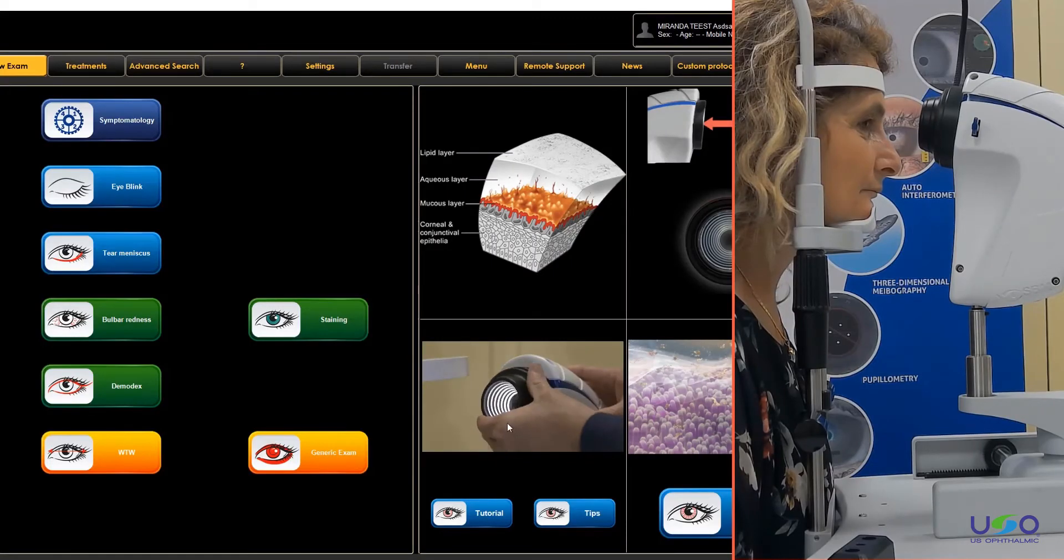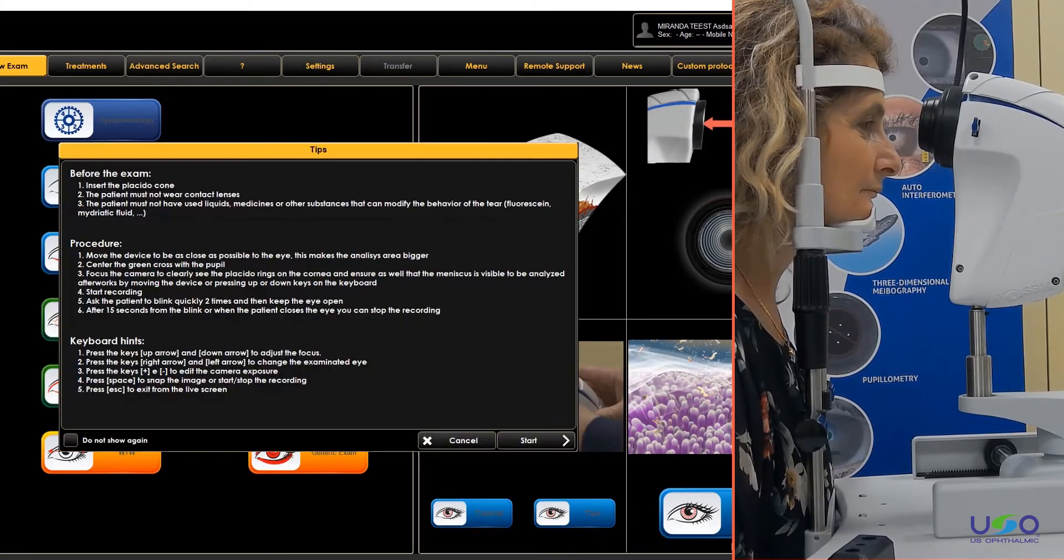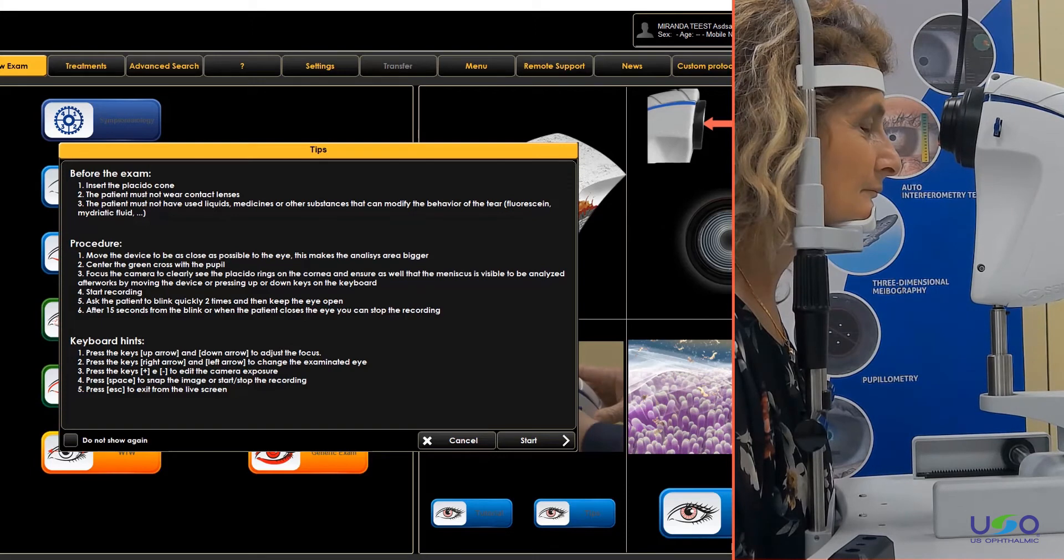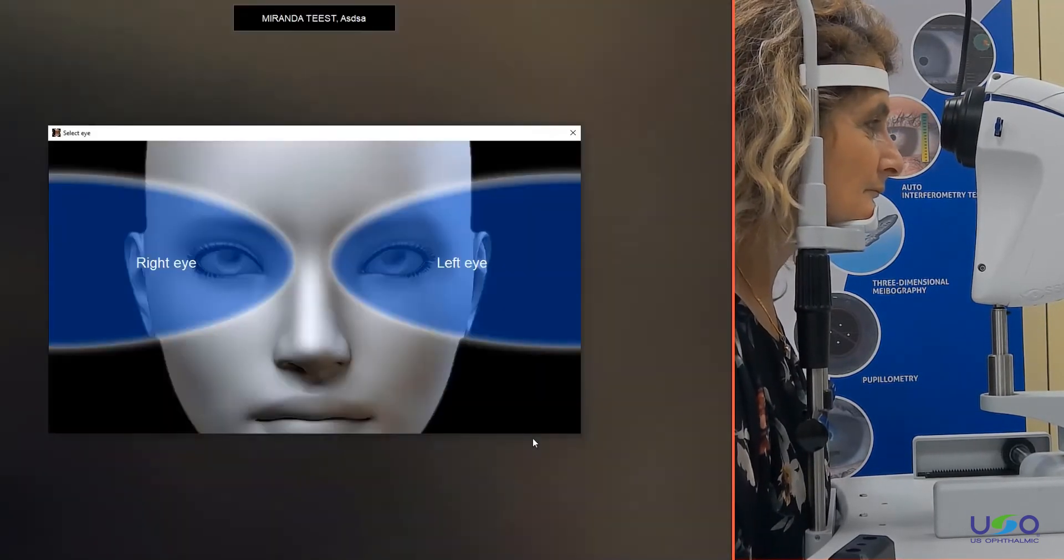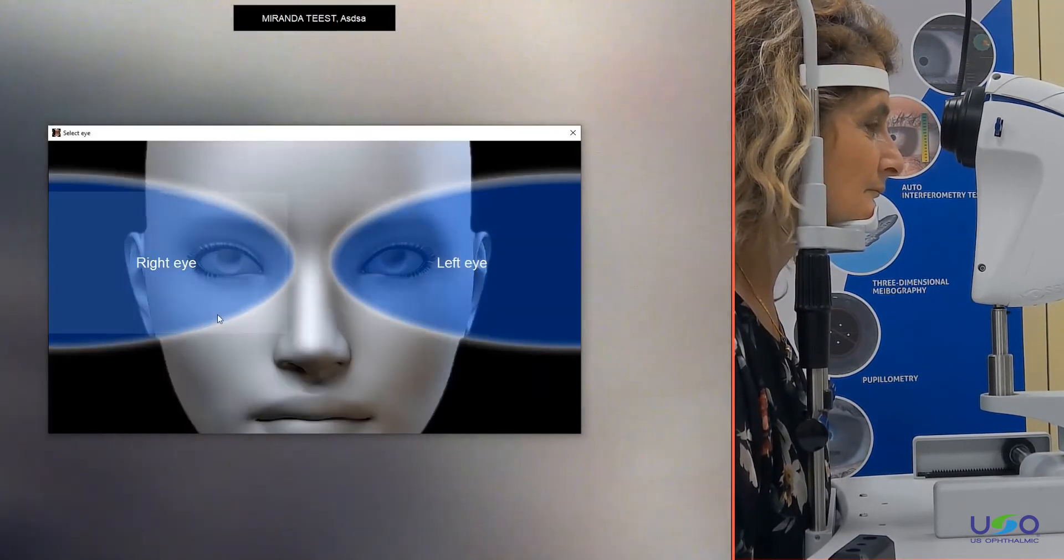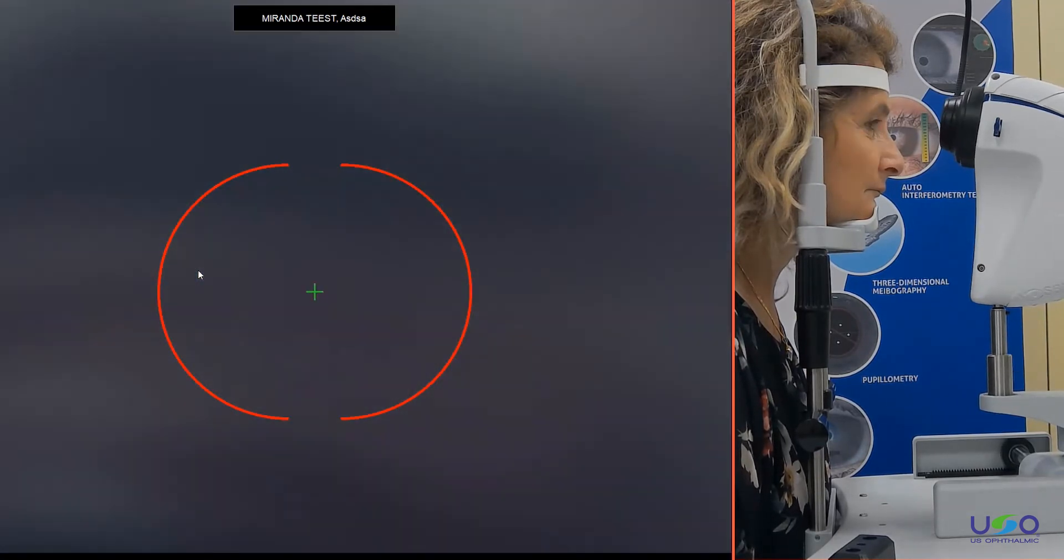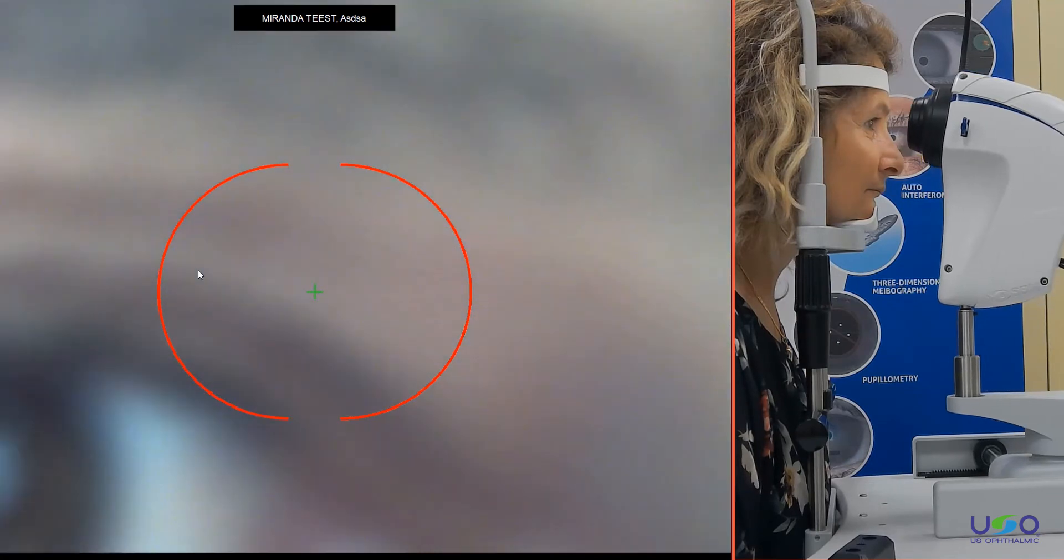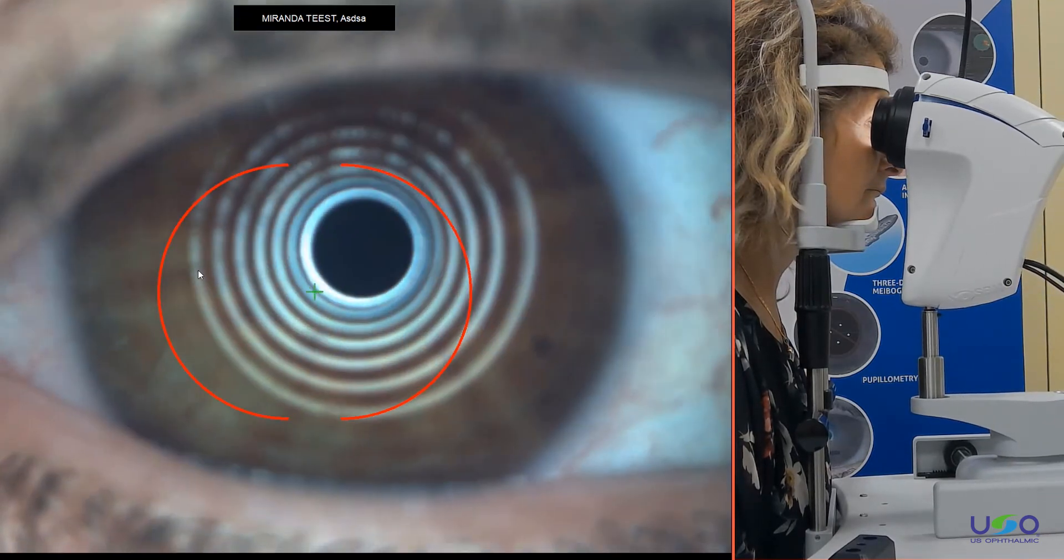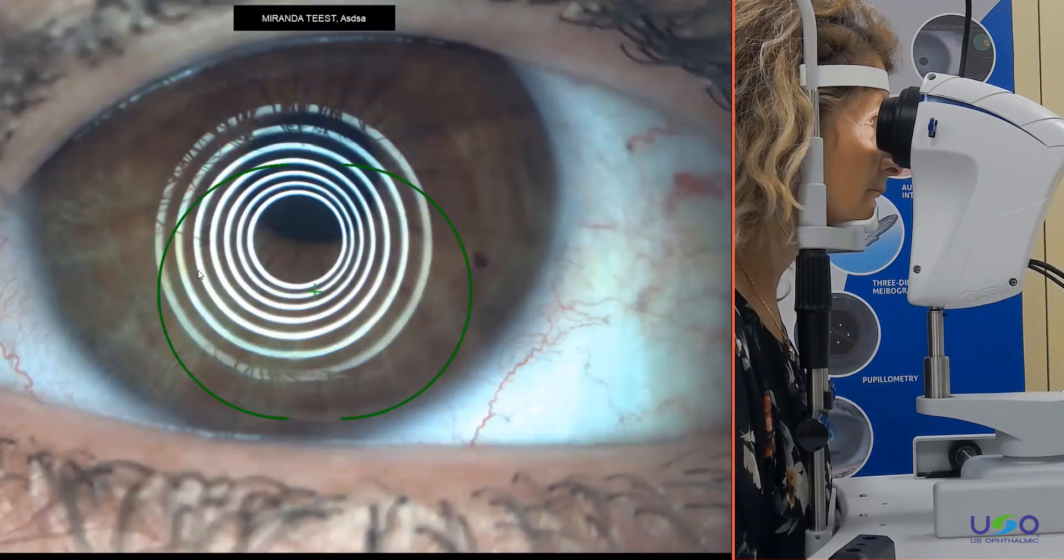Now we start the examination. We ask again to fit the patient on the chin rest, as she did now. We select the correct eye, as always, so I will push on the right eye. I tilt a bit again my device and I go for the cornea of my patient.